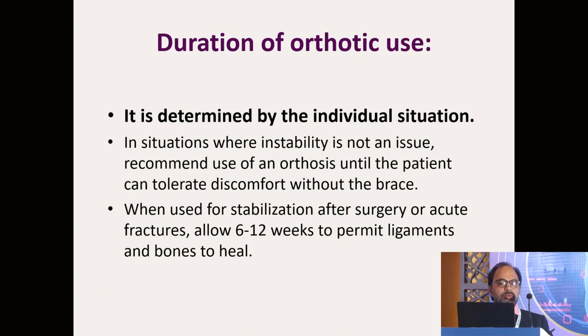Duration of orthotic use is determined by the individual situation. In situations where instability is not an issue, use of an orthosis is recommended until the patient can tolerate discomfort without the brace. When used for stabilization after surgery or acute fractures, allow 6 to 12 weeks to permit ligaments and bones to heal.